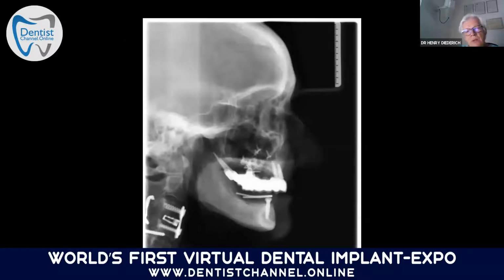And here also, another time, see the angulation of your pterygoid implants, freehand, and the result after 10 days.